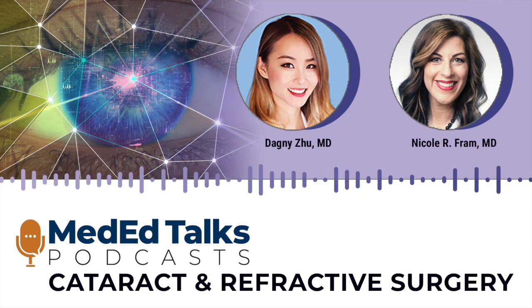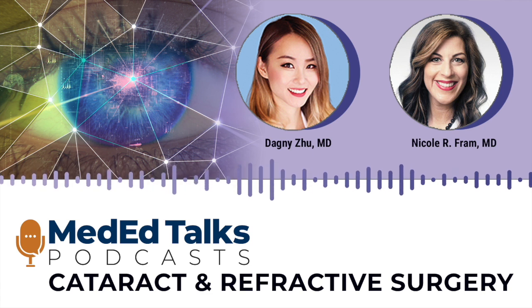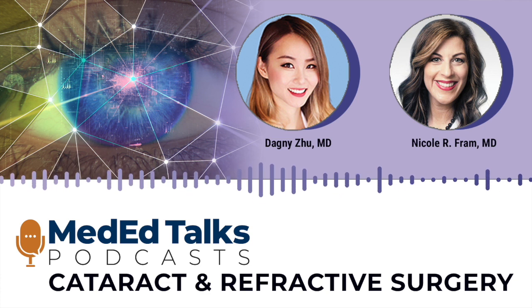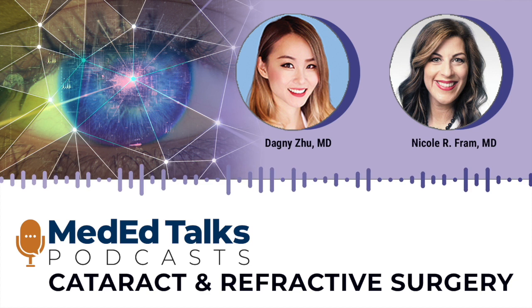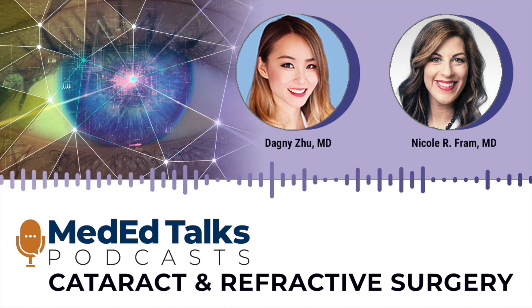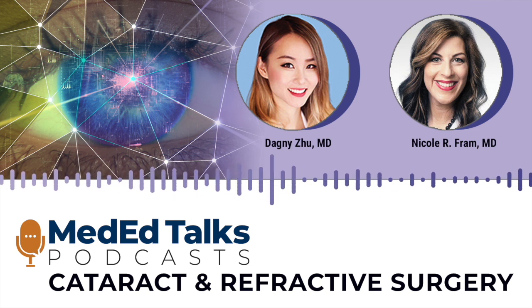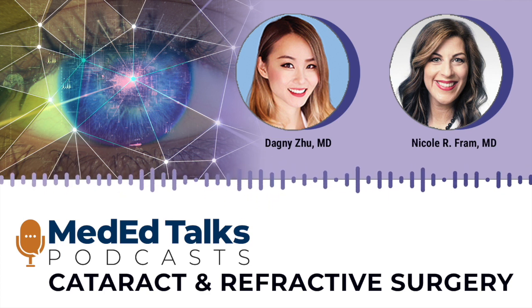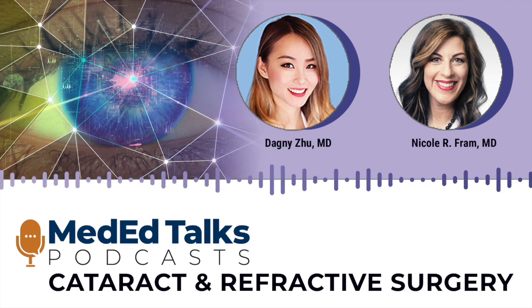So there's been some really incredible publications on this. I think the retina doctors have shown us that intraoperative OCT with epiretinal membrane peeling can be very beneficial. But what does it do for a cataract surgeon, an anterior segment surgeon? There are some great papers that were presented at Academy and ASCRS on looking at posterior polar cataracts and understanding where you actually are in the eye and how to protect the posterior capsule. So I do think that can be an advantage during surgery.